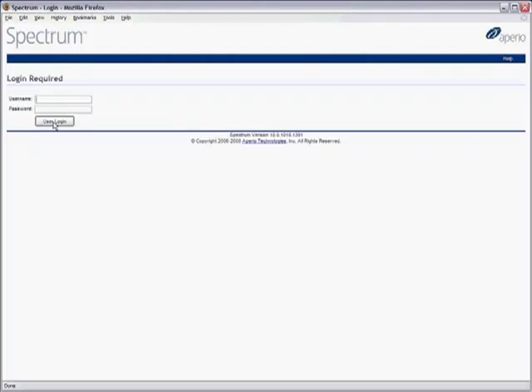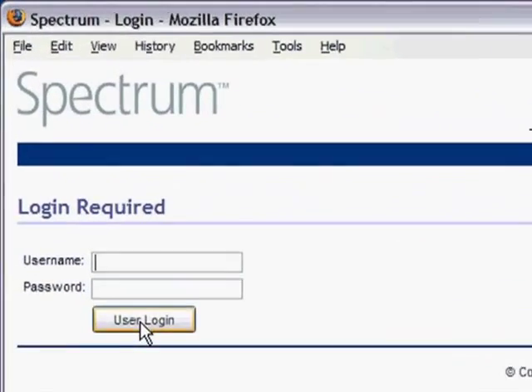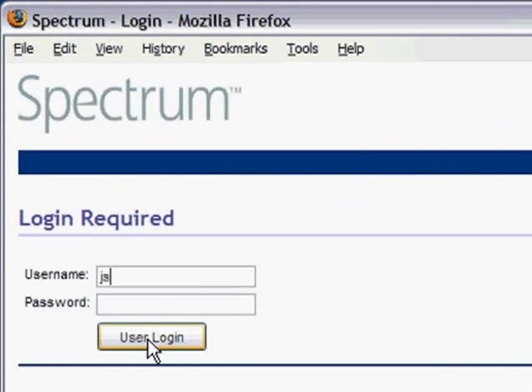Pathologists can now read slides anytime, anywhere, as soon as they are scanned. Log securely into Aperio's web-based digital pathology information management system, Spectrum.